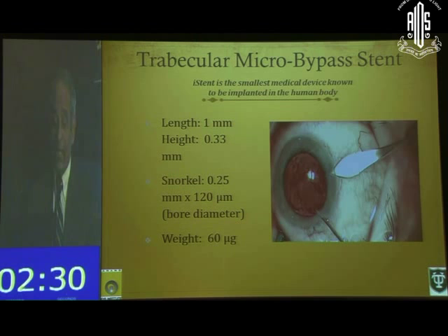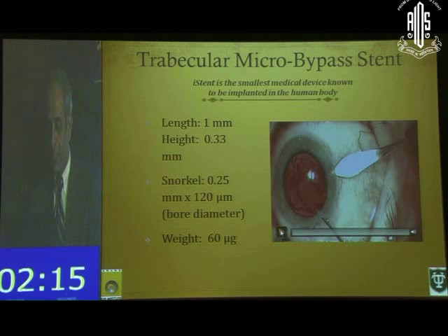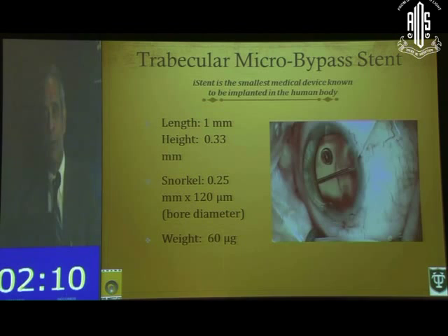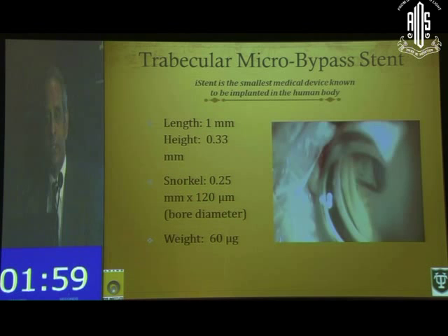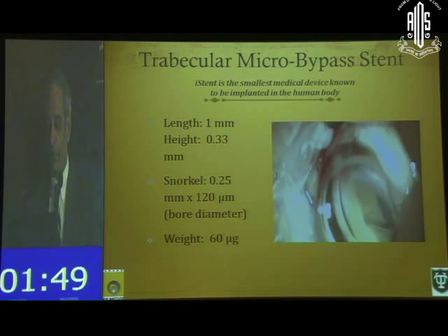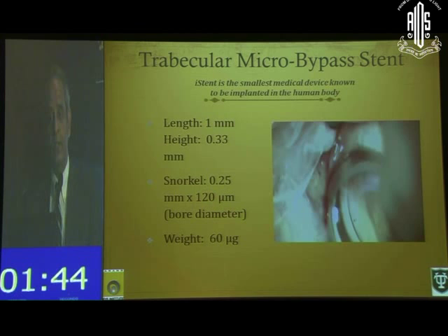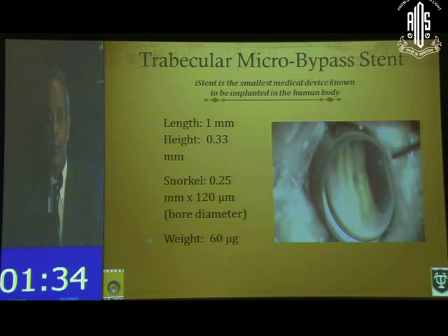The next canal surgery is the Trabecular Micro-Bypass Stent — the iStent — the smallest medical device known to be implanted in the human body. It measures approximately 1 mm in length and 0.3 mm in height. It comes on a plunger similar to the Ex-PRESS shunt. You make a clear cornea temporal incision, fill the chamber with viscoelastic, and under gonioscopic view introduce the stent into the trabecular meshwork at approximately 30 degrees. Once in the canal, you release it so the snorkel is visible through the anterior chamber. The learning curve is steep but the procedure takes about 5–6 minutes once mastered. It can be done combined with cataract surgery or standalone, and is excellent for mild-to-moderate glaucoma.